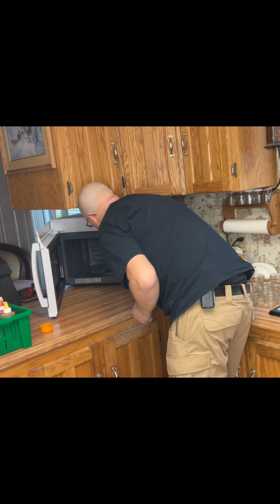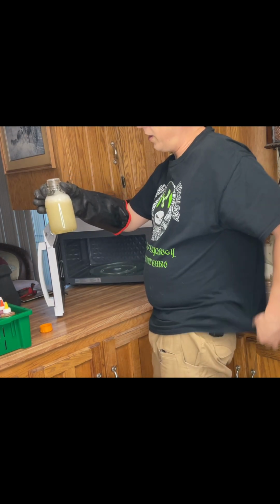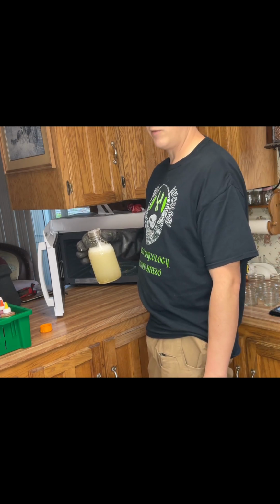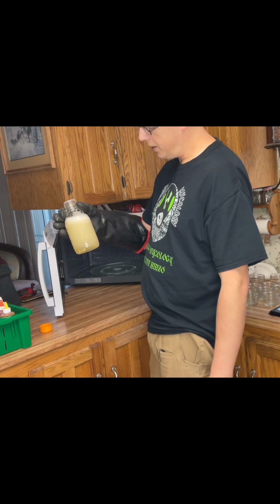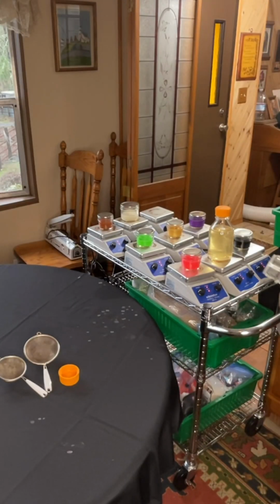Alright, you can see there it's kind of turned white and foamy. That's our sign to go ahead and pull it. We'll throw it on the magnetic stir, turn that puppy up on the heat, let it stir and get this thing going clear. And then we'll come back and we'll filter it. See you there.